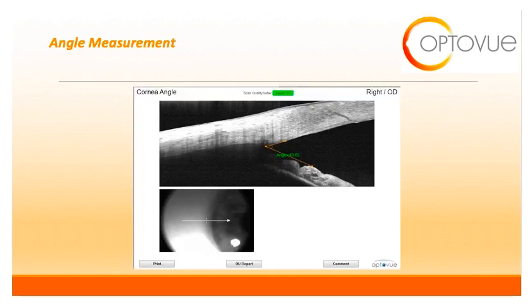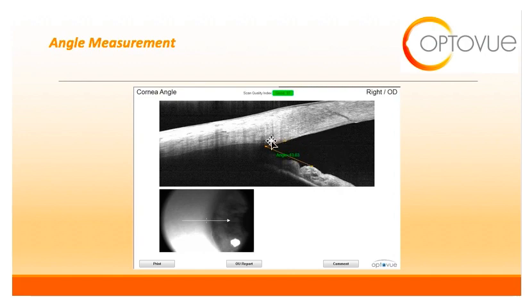This slide shows you what a normal anterior chamber angle should look like. You can use the calipers on the OCT to measure the angle — this angle is wide open. We put our calipers on the most posterior edge of the cornea and the most anterior part of the angle, which is your ciliary body band, and this would be the measurement of the corneal angle.